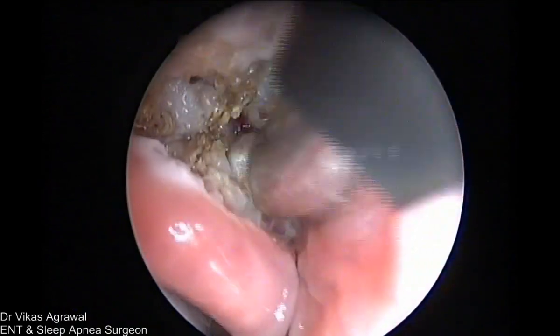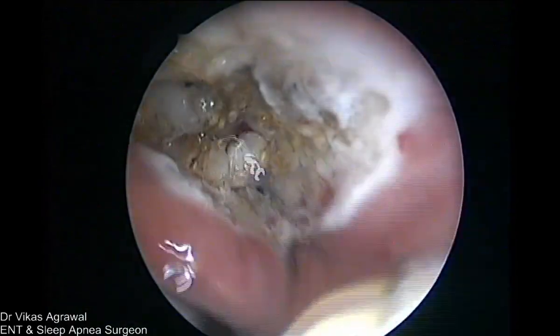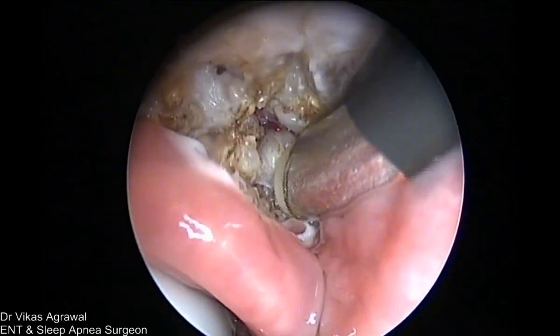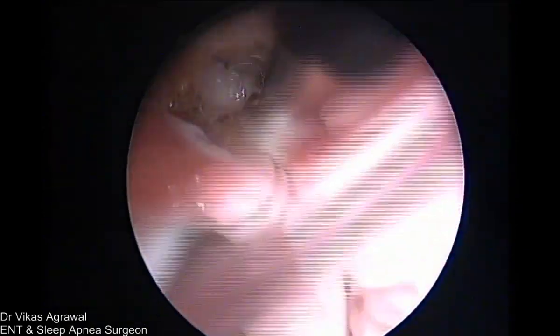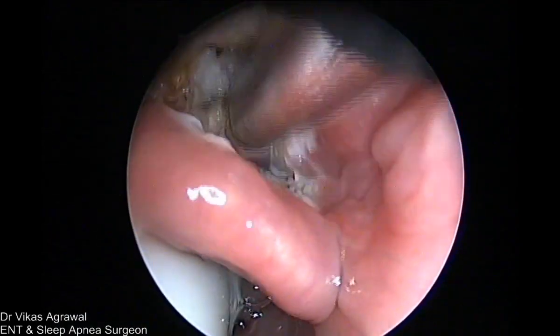because tongue is a skeletal muscle. After 20-25 minutes, it will start going into ischemic changes. Can you see what I'm doing? This is all lymphoid tissue. I'm first coagulating, then ablating, and then again coagulating, so that I'm removing this.